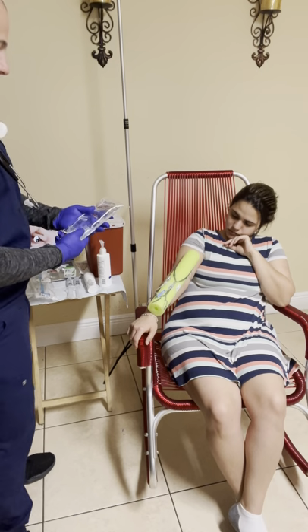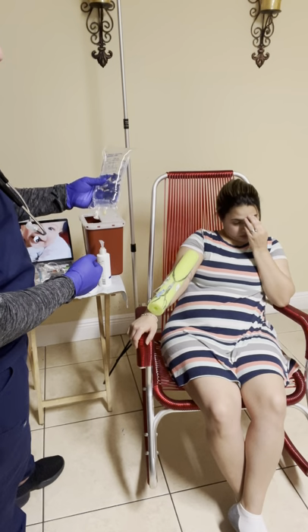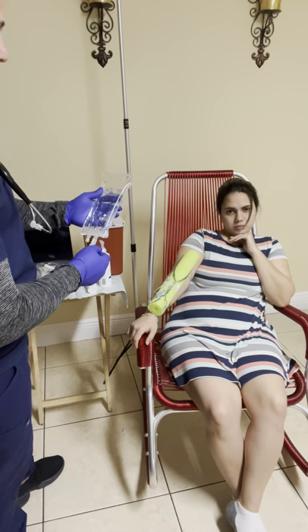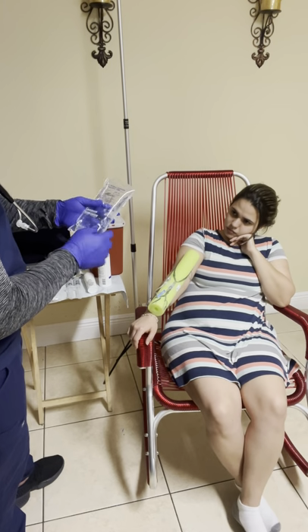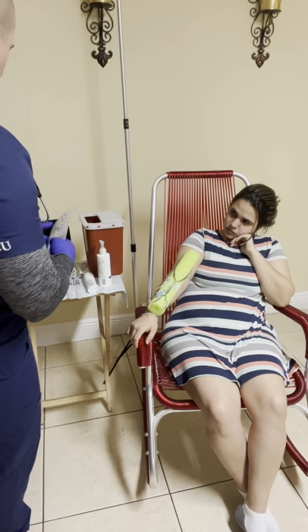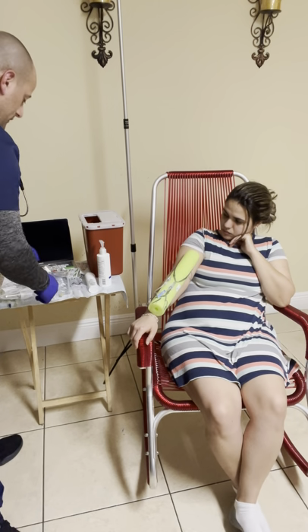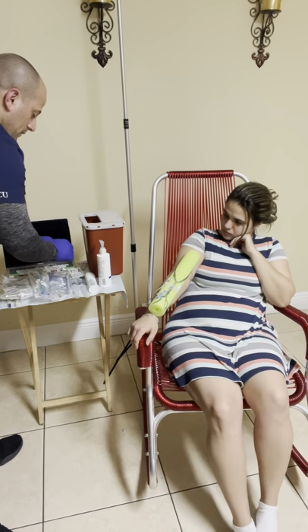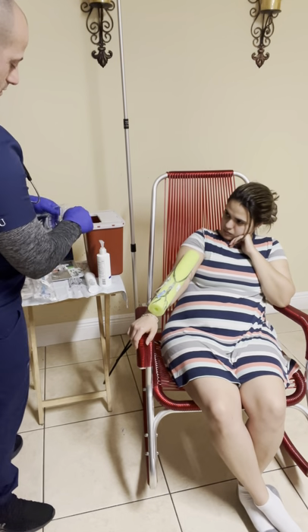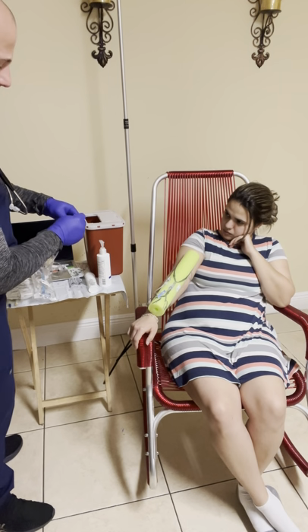I have to check the IV bag for expiration. Also, if the solution is clear, any color, everything looks fine. Now I have to gather all the supplies. I'm going to clean the port right here.